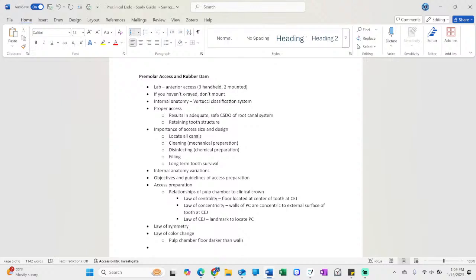Using that endodontic explorer is important too, a nice sharp one. I know you're going to want to reach for just your normal explorer, but using the endodontic explorer is much more effective and efficient. Having practiced as a general dentist for about 7 years, I know having extra instruments can be expensive, and it can be tough to have your assistants put together and flip rooms for different procedures.